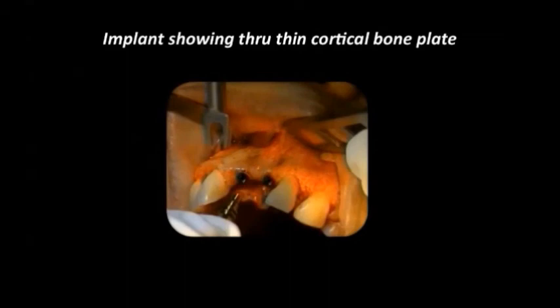After the two implants have been placed, you can see the thin cortical bone and the buccal defects. If you look at the two laterals, you see how much bone they are covered. If you see the implant, it's a very thin buccal bone. So this is what I was talking about earlier, that we have to augment when we see this kind of thin bone.